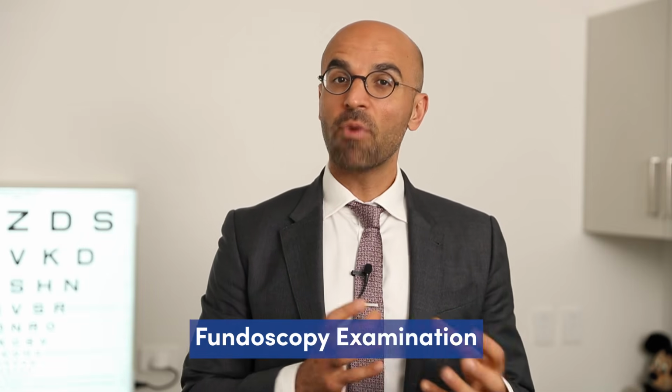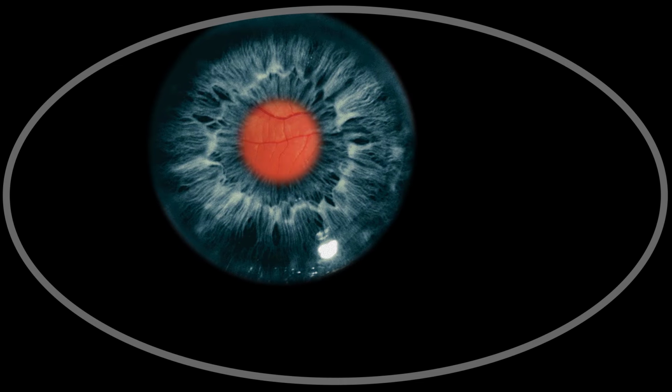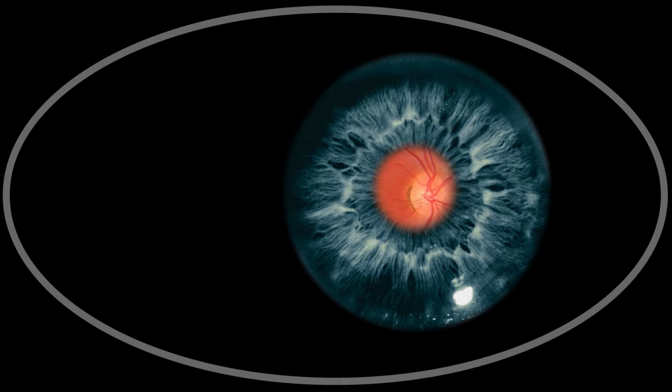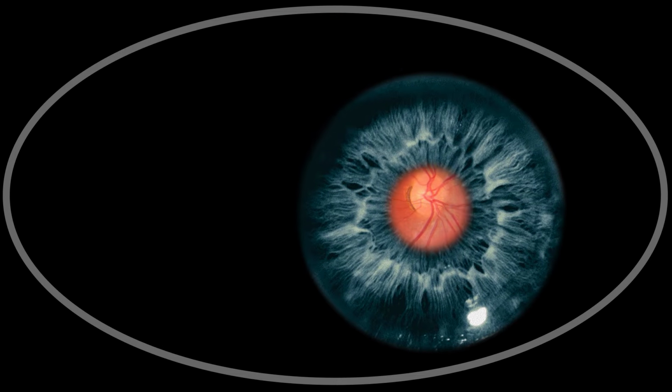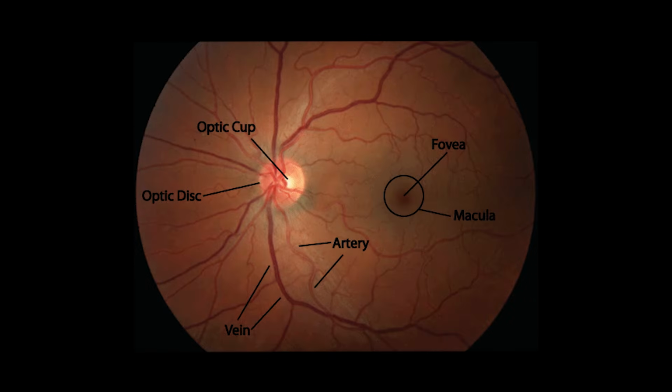Looking directly into the pupil, you'll see an orange-red color first, which is the retina. Now move around, adjusting the lens power until some feature comes into focus, and often this is a retinal blood vessel. So retinal blood vessels consist of paired arteries and veins, with the veins being wider in caliber and darker in color. Follow the course of a pair of vessels to get familiar with what normal looks like.